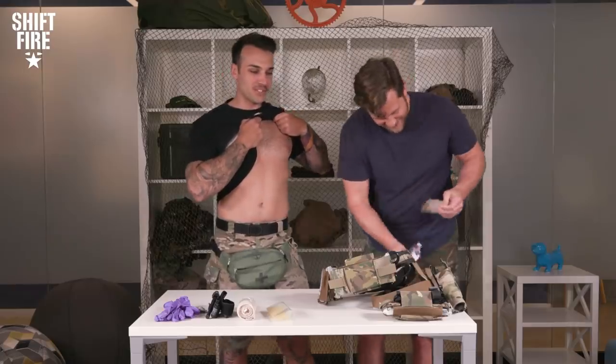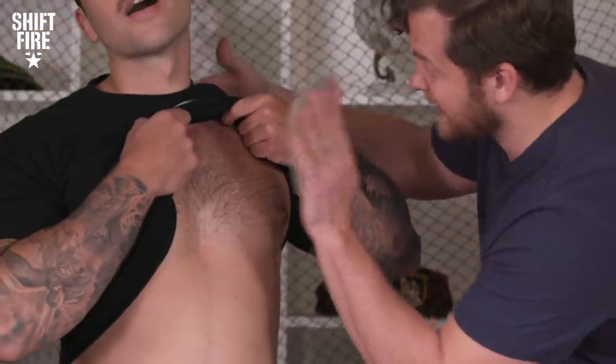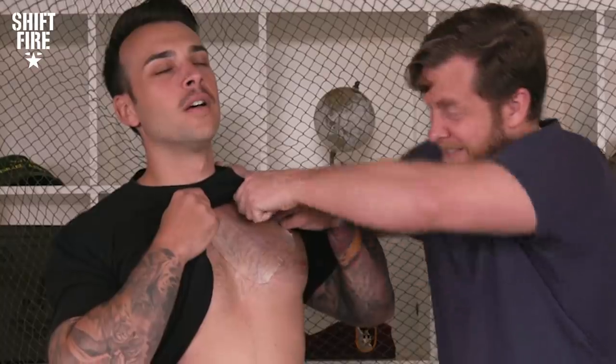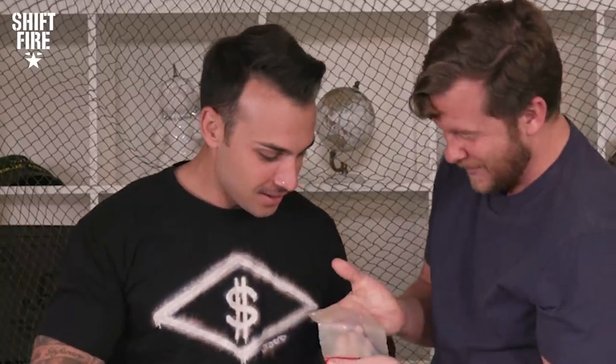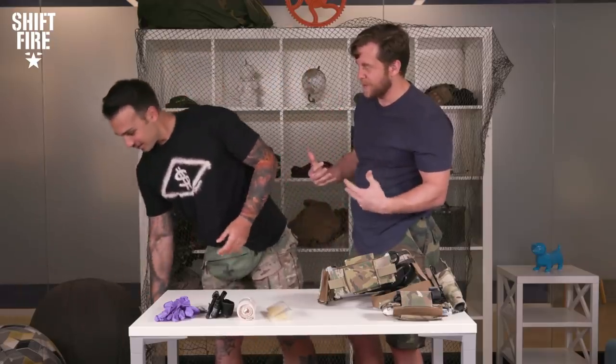I want to test the prank theory with a halo seal. Cameron has a hairy chest — we're going to apply one and see how sticky these really are. Apply it firmly — all about placement and firmness. Peel it off quickly — you got a few hairs. Should've let it sit a little longer, but it was true to life because on a real casualty it would stick hard. Anyway, that demonstrates just how sticky these occlusive dressings are.